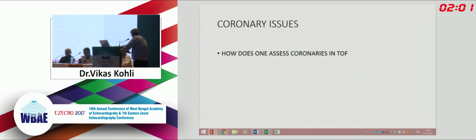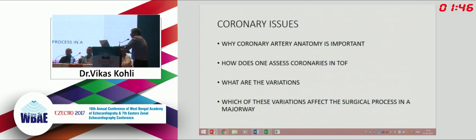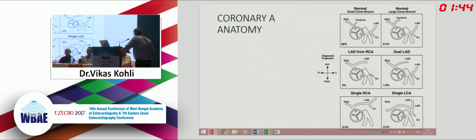As it is a very near field structure, important is we should use a transducer with a high megahertz, from 5 to 12 megahertz like that. That is important, and gain setting is very important. It should be lower gain settings, and the compression should be higher.